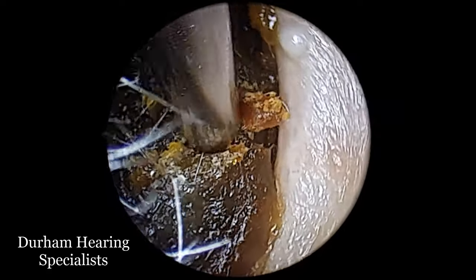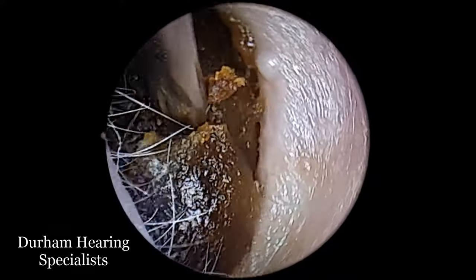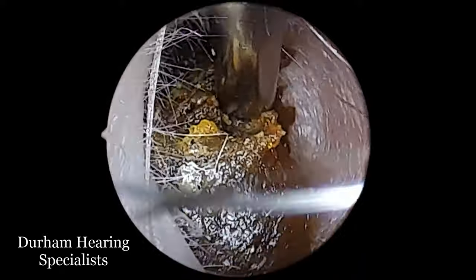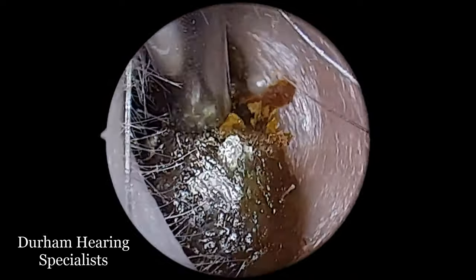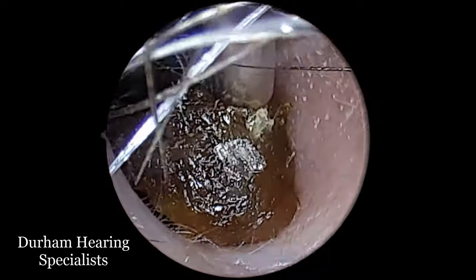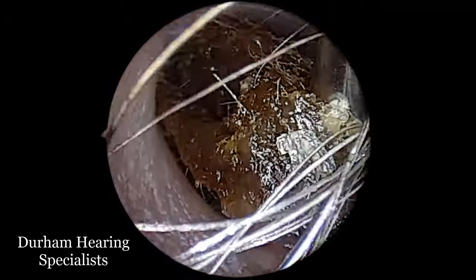but actually these are very small controlled movements in the ear canal. What I'm trying to do is essentially articulate this very awkwardly shaped large piece of earwax out of the ear canal, which is rather bendy. It's really just about going in circular movements and up and down, side to side, just to try and get some position and purchase on the earwax mass.